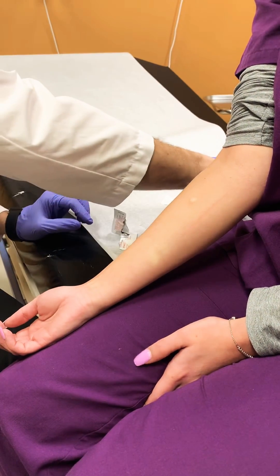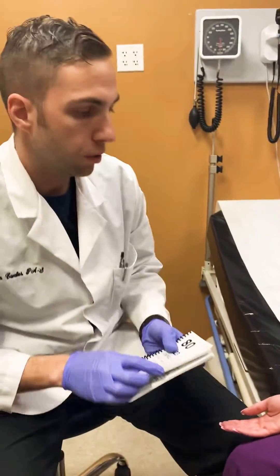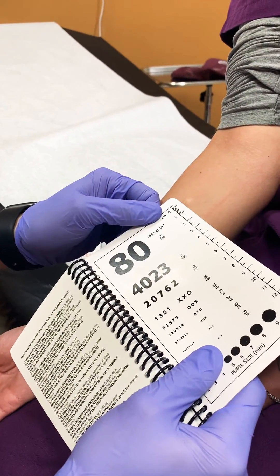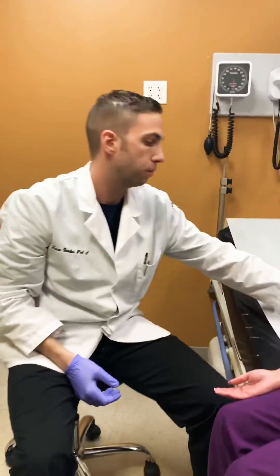Now that's done, I will dispose of my needle. For an accurate PPD, the wheal needs to be between 6 millimeters and 10. I have my ruler here and I can measure that — it looks like it's about 7 millimeters. She will return in 48 hours for a proper PPD read.